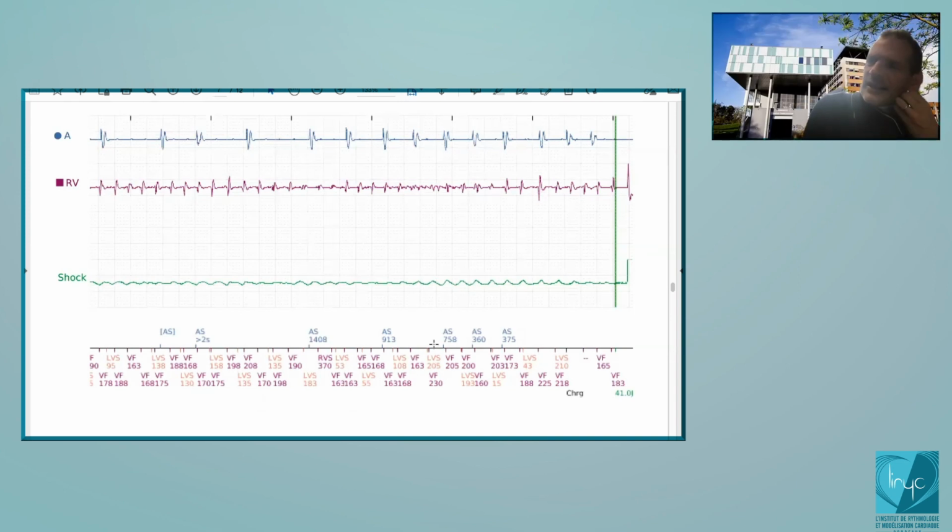The only one which is non-committed is the first one. If you start, then the second, third, there's always a redetection phase, of course. But if you reconfirm, and then at the end of the post-shock duration of 1 second, you consider that you're still in arrhythmia, if you start the charge of the capacitor, then you will deliver the shock at the end of the charge. It's clear?